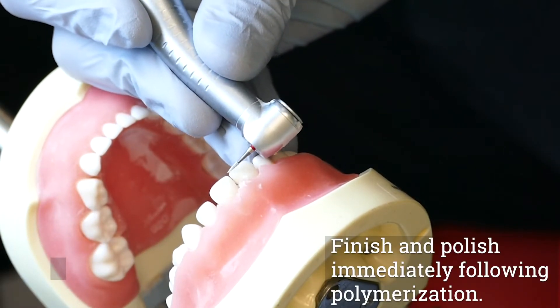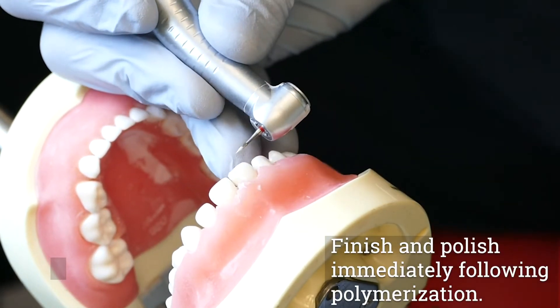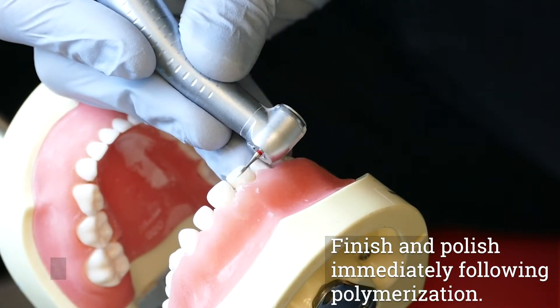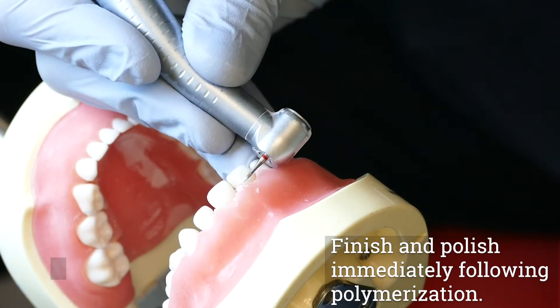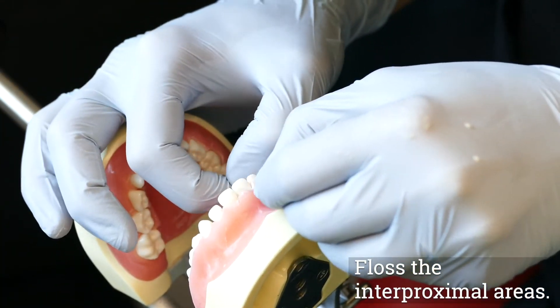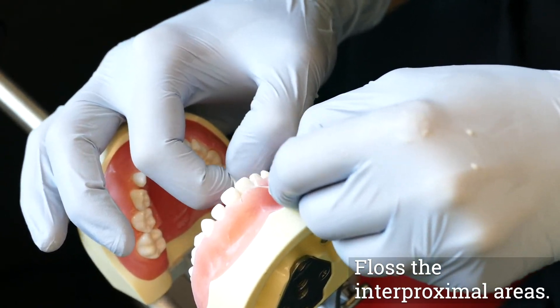Finish and polish immediately following polymerization. Floss the interproximal areas to check for overhangs and to remove excess glaze material.